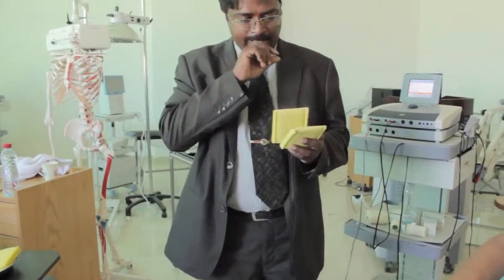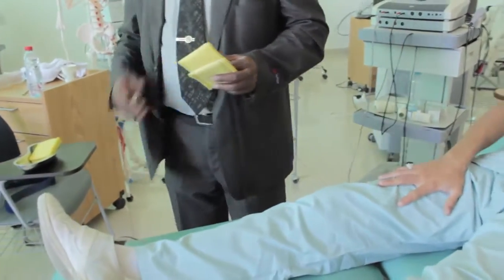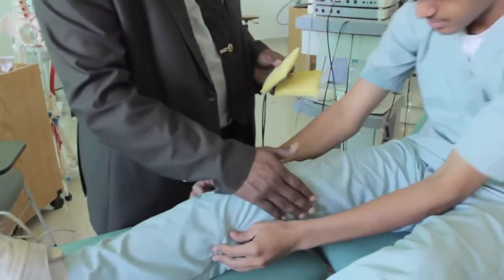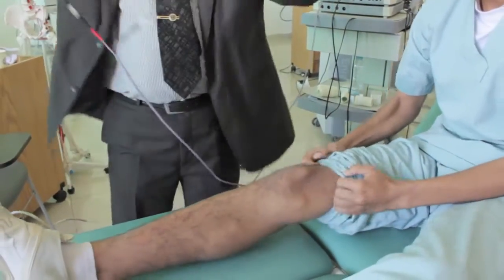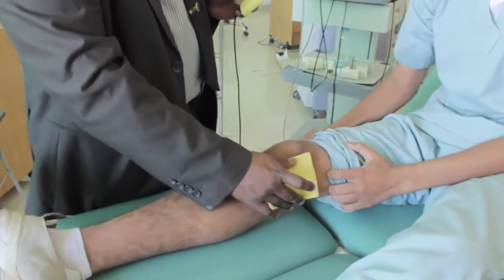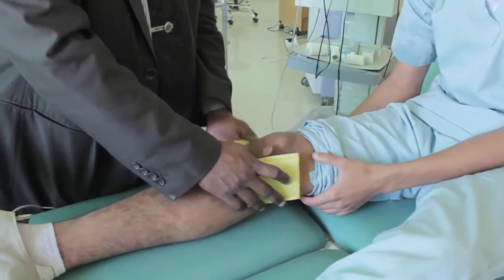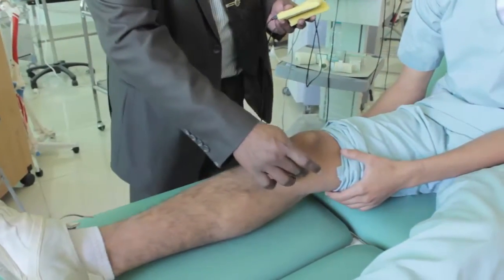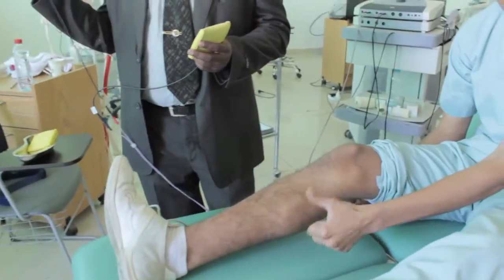Now, for the knee joint, sometimes the patient may have knee joint pain or knee ligament injuries. Most common is medial knee ligament injury. Again, anode on the medial aspect of the knee, cathode on the lateral aspect of the knee. If the patient complains of pain in the medial knee joint, so wherever pain, there should be anode.